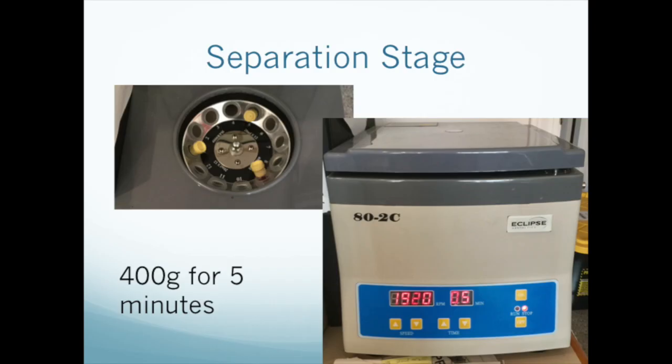Place the tubes into the test tube centrifuge, spaced equidistantly. Spin at 400 g's for 5 minutes. You'll have to calculate the correct RPM since each centrifuge is different, and we're targeting the platelet layer, not the bottom of the test tube. Please view our video on centrifugation for the details.